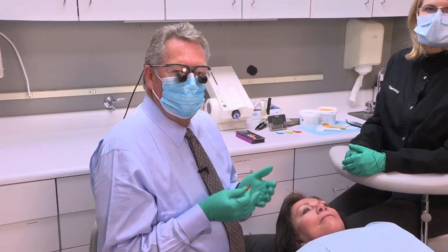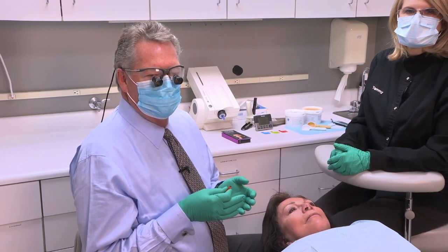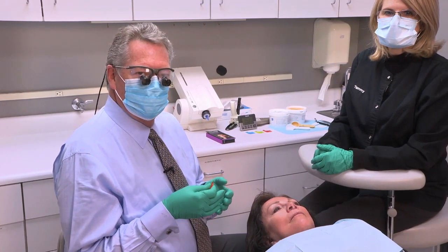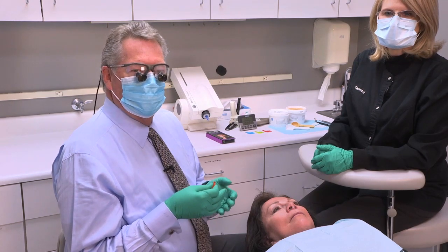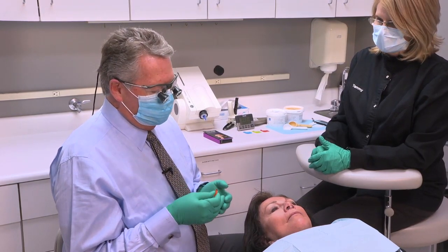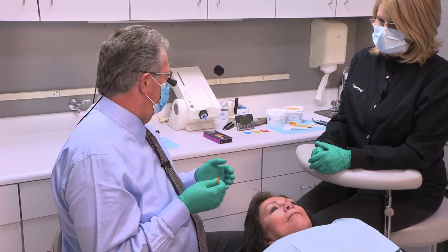So the question becomes, where do we set the bite? So what we found is Kim did better at 6 vertical, 2 or 3 horizontal, but we know that all the appliances can move approximately 5 millimeters forward. So I would like to have the latitude to be able to advance the appliance forward slowly. So we're going to start with 6 vertical edge to edge.